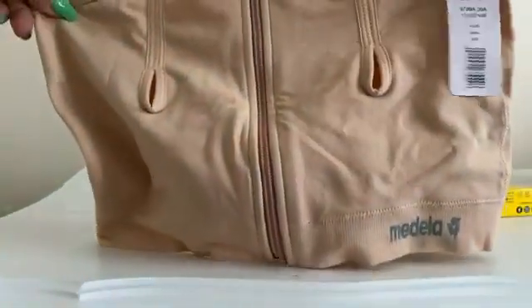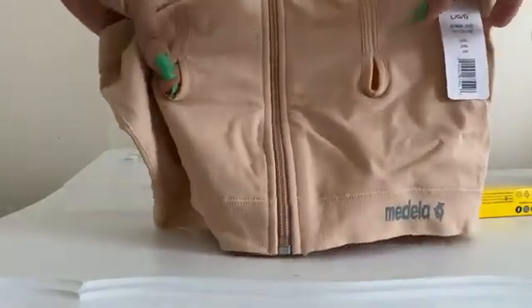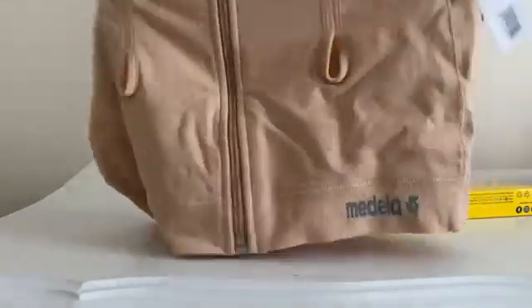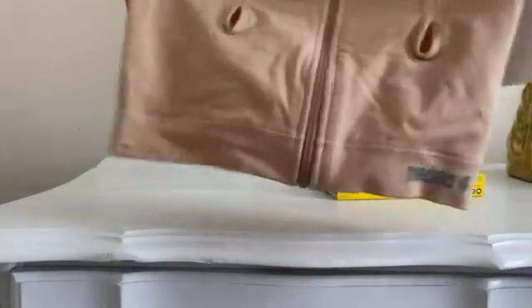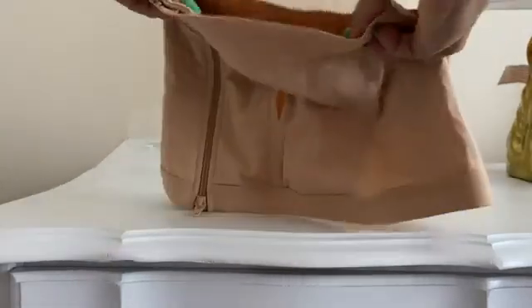The bra itself looks like this. You have the holes right here where the pump will actually go. It's pretty stretchy — let me move it back so you guys can see a little bit better. It's stretchy right here and in the back too.